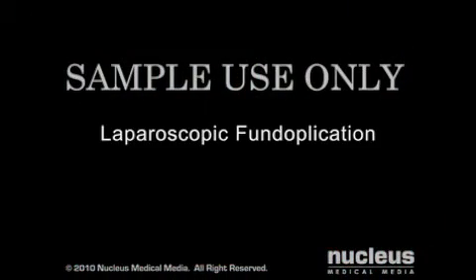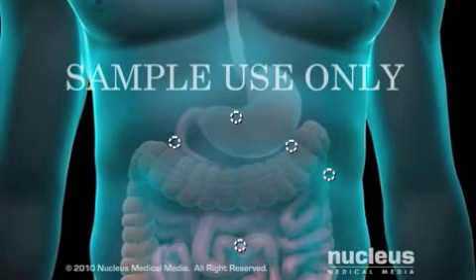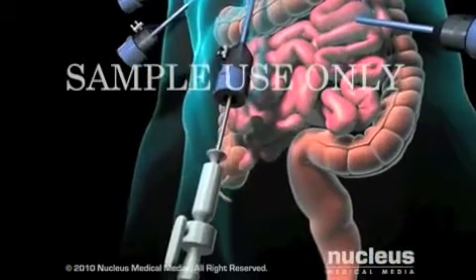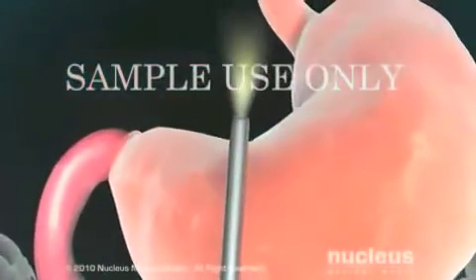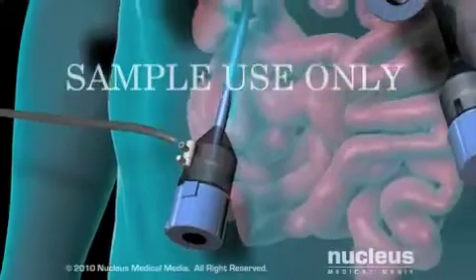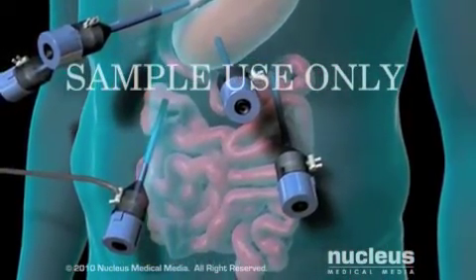In the laparoscopic procedure, your surgeon will begin by making five small keyhole incisions, each about one-half inch long, in your abdomen. Through one incision, your surgeon will insert the laparoscope, which is a long, thin tube equipped with a light and a camera. The camera sends images to a video screen for the surgeon to view. Gas will be pumped in to inflate your abdomen to enable the surgeon to see your internal organs more clearly.